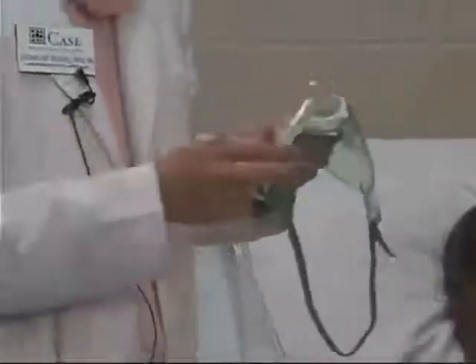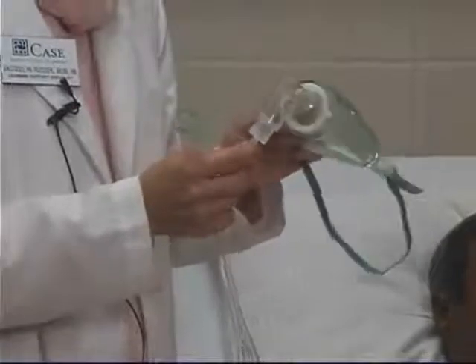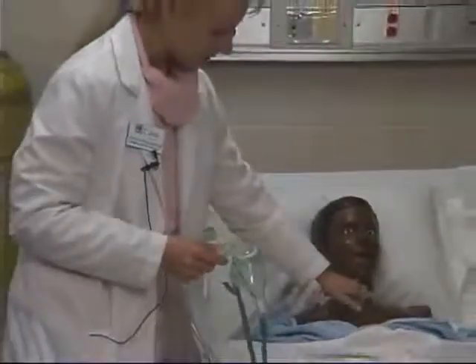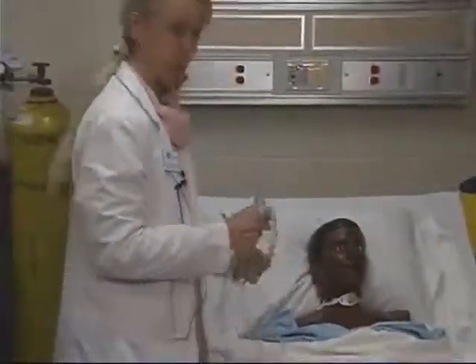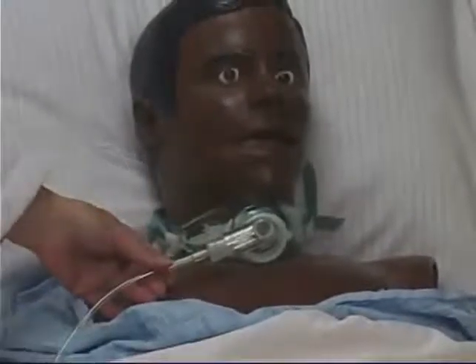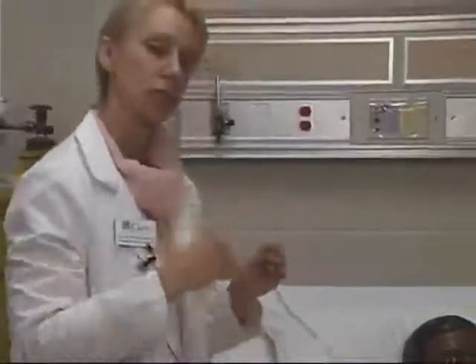I also wanted to show you very quickly an oxygen delivery device called a trach collar, and you will see these on a medical floor. This is not necessarily just for a critical care unit, because many patients have trachs. This is a trach, and you may see this patient on your floor, and to deliver oxygen to this patient, because this trach is now going directly into the lungs, you'll see a mask like this around the patient and directly over the trach. And then the end of this tubing will be hooked up to the flow meter, and you will set the flow meter according to the liters per minute ordered by the physician or advanced practice nurse.